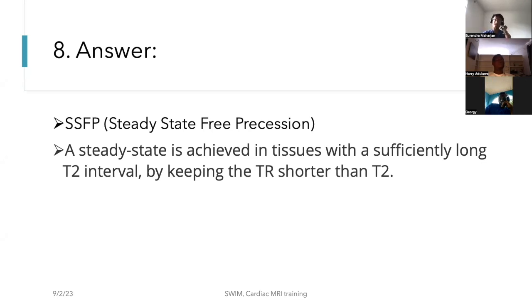And it's very important because it generates T2 by T1 contrast, which is quite good and quite sensitive for cardiac MRI, since its contrast is very good for minor details in cardiac MRI where the muscle and the tissue are similar.